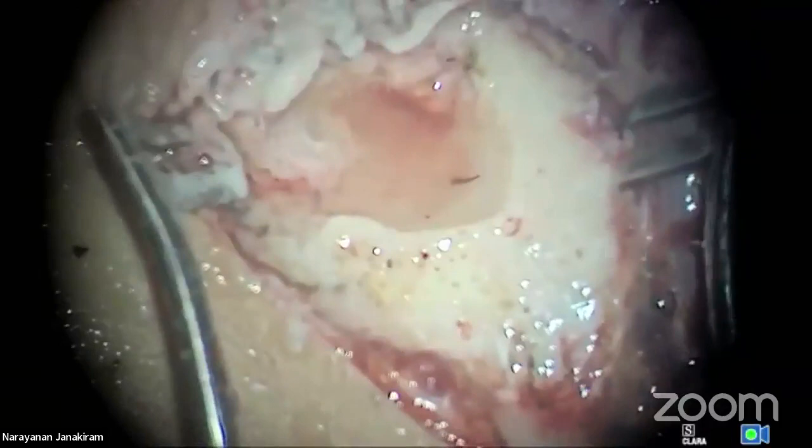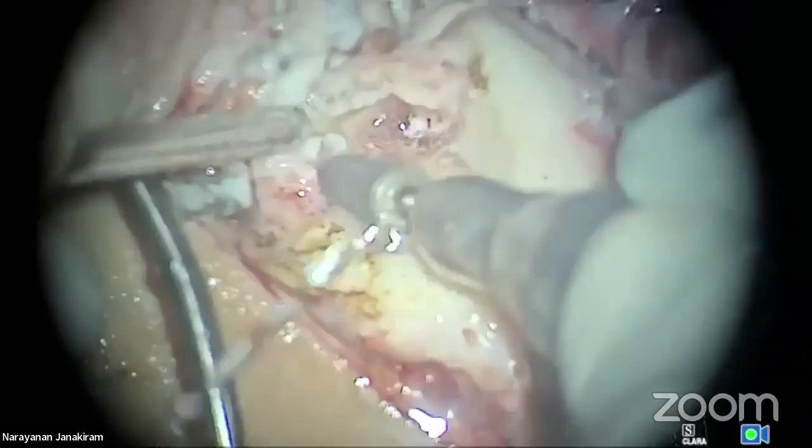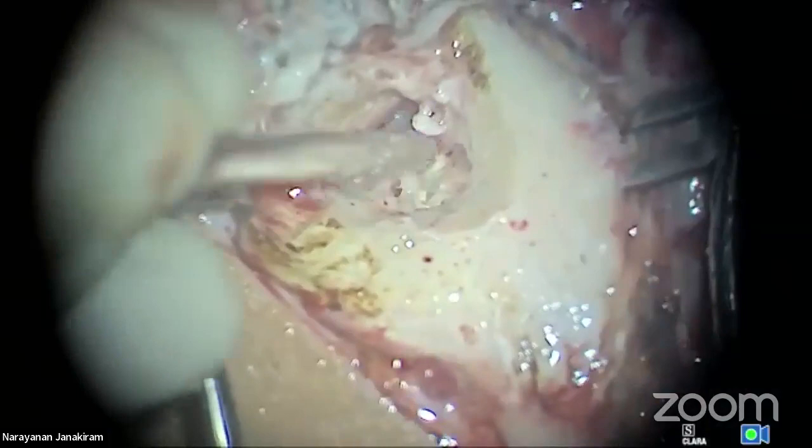Now you see the C technique. You go lateral to the, where are you? You're going lateral to the annulus. Can you see? Deepak, give me bipolar now. Can you see the cholesteatoma here, all of you, in the posterior canal wall? Yeah. Bipolar, please.